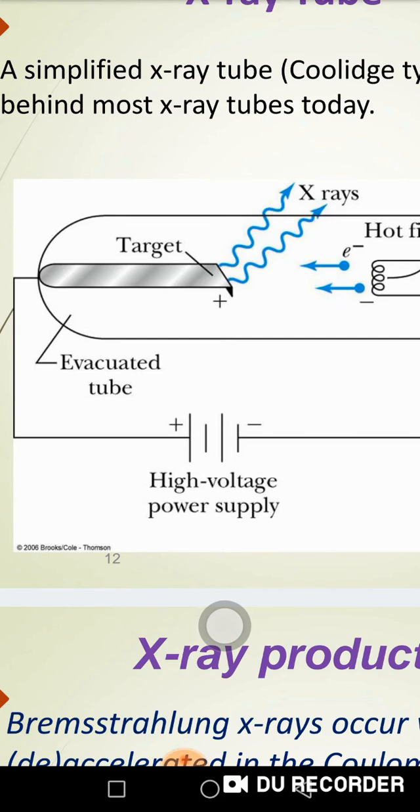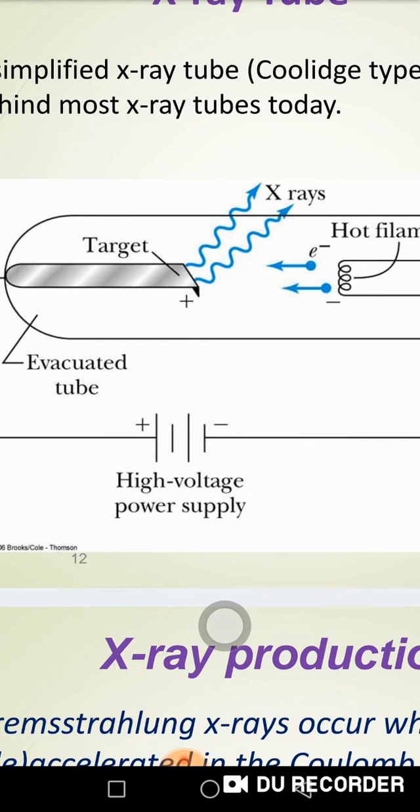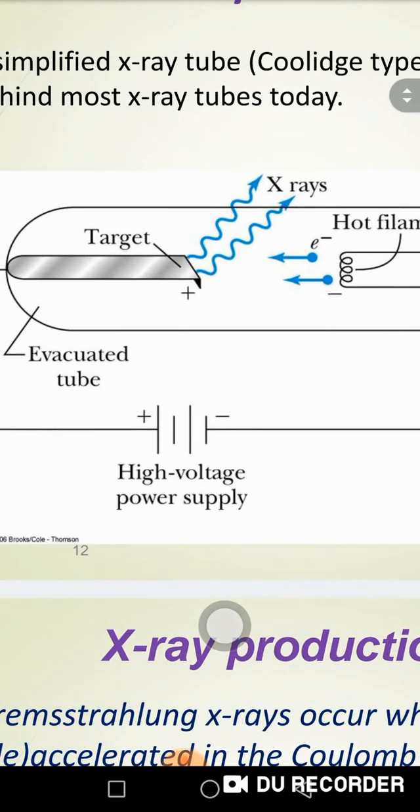You might ask yourself why to increase it. When you provide higher energy to the electrons to move, you increase the probability of interactions that would occur. The interaction probability allows you to reach the nucleus of the atom and produce the primary X-ray, as we will discuss later about X-ray production and the probabilities that occur with X-rays.